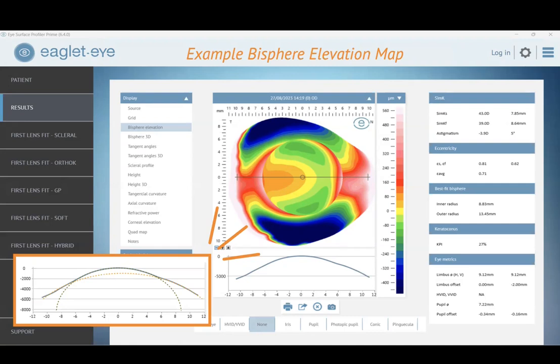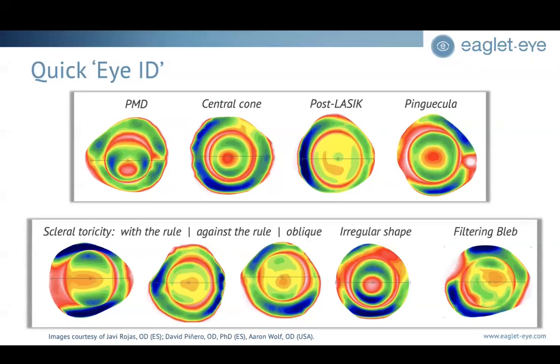So, if we think about our characteristic keratoconus eye, we see that hot spot of red in the bottom, the inferior, where the cone could be. We're used to seeing a certain pattern. And that's why this is a really, really cool figure that gives us an idea to also show some of these characteristic patterns.